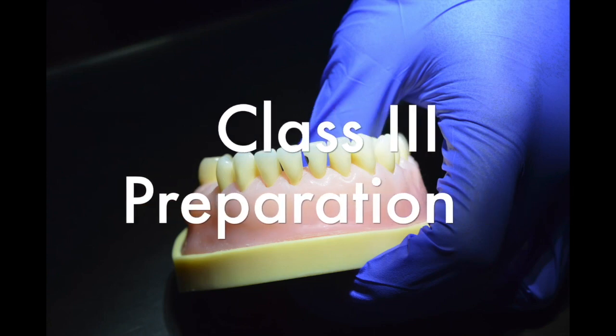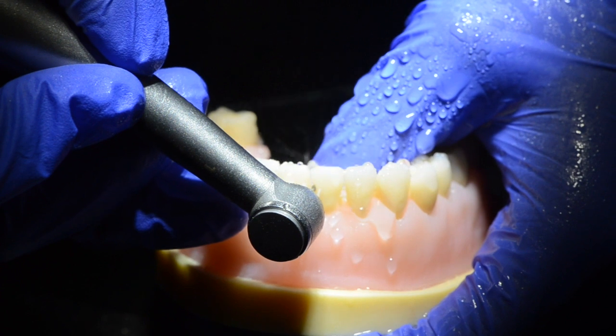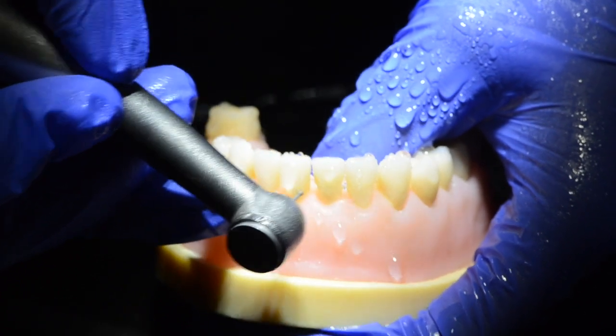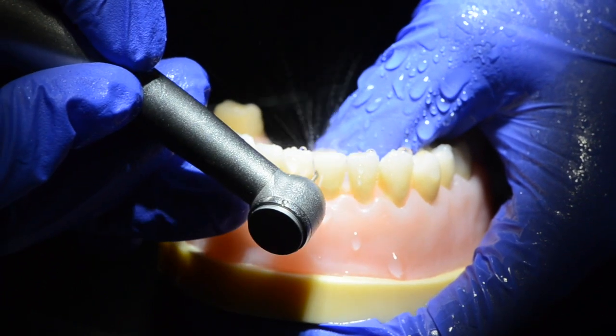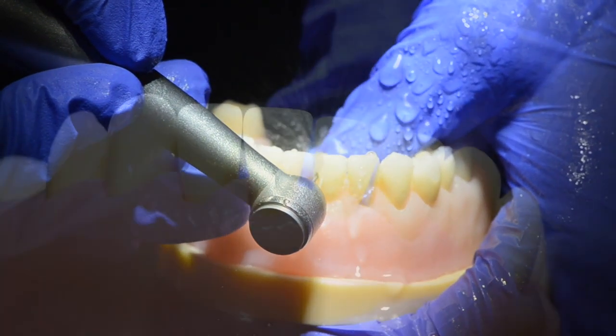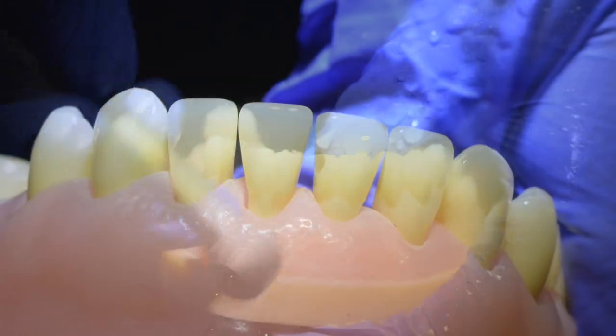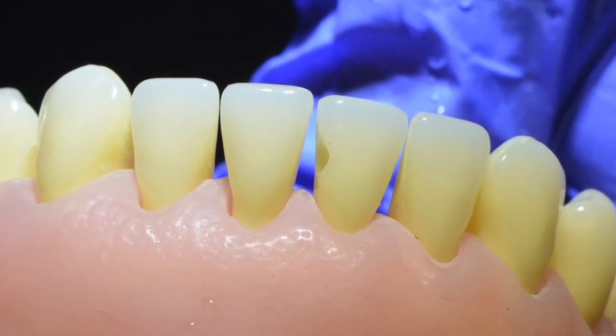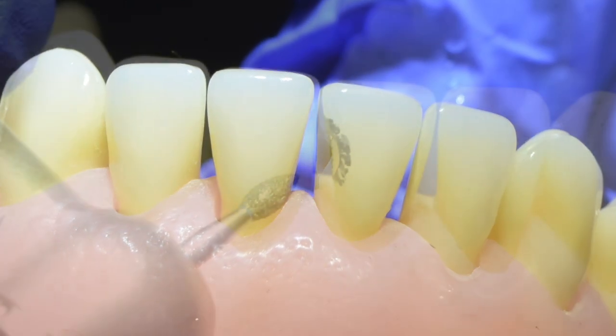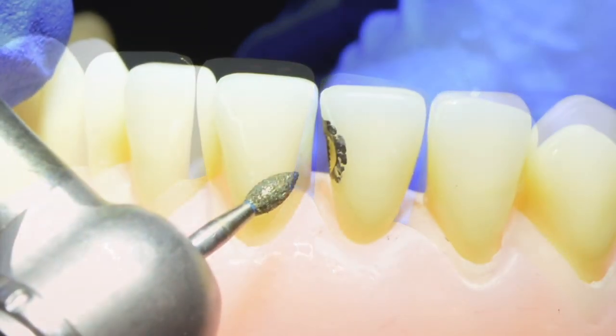Hi and welcome to the Dental Advisor. Today we tackle the Class 3 preparation for modern resin composite restorations. We will start with creating a typical textbook Class 3 cavity, and to this we will apply a traditional bevel which is most often practiced in our clinics today.